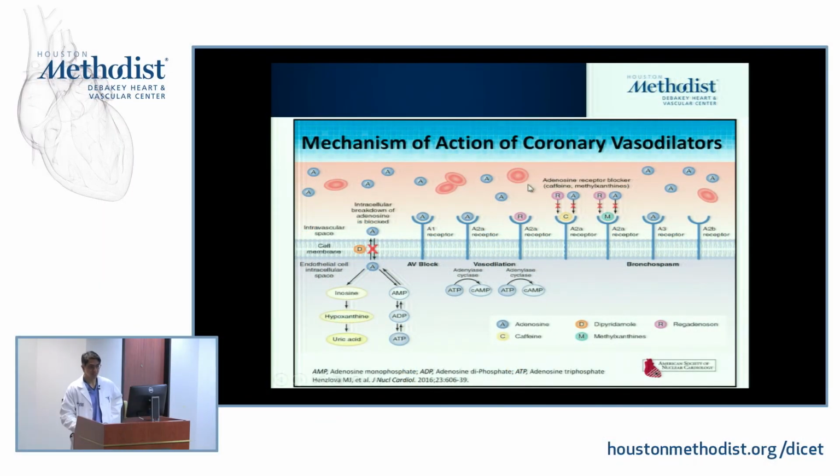This competition is provided by caffeine and methylxanthines. So part of the reason why you tell patients, please don't have a cup of coffee for at least 12 hours before your stress test, is because caffeine will go and occupy these receptors and you will not get maximal hyperemia.